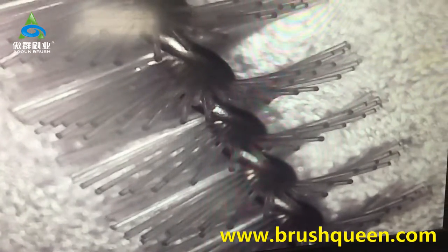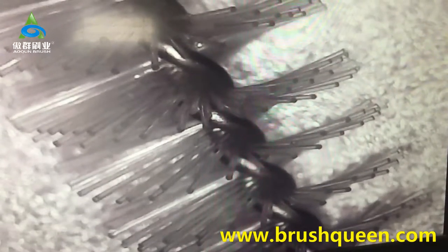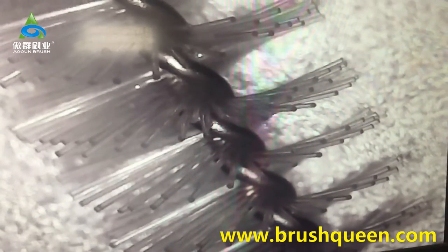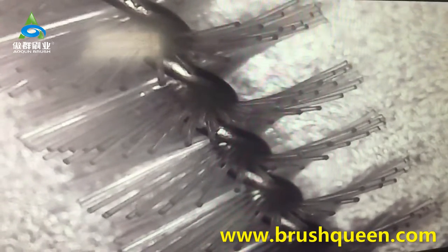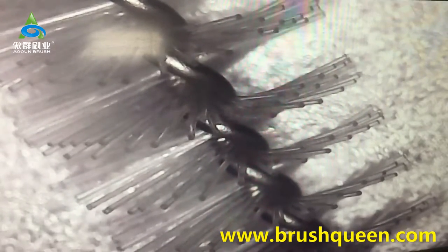We also put the Outrin Brush under the microscope and enlarged 30 times. You can see the surface of the filament is smooth, no burr — especially important in medical instrument cleaning. No burr can not only ensure the ideal cleaning effect, but also decrease the safety risk and prevent infection.